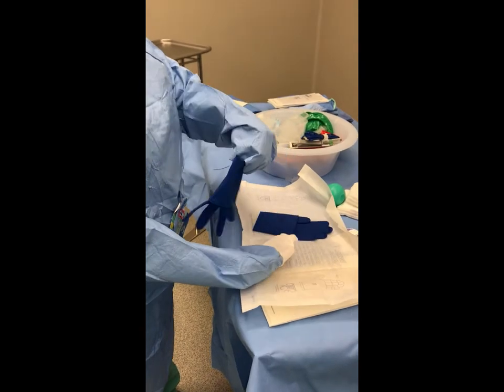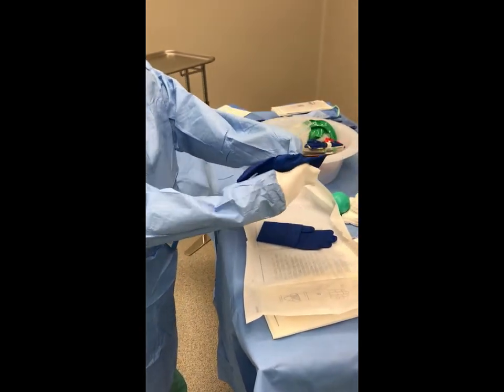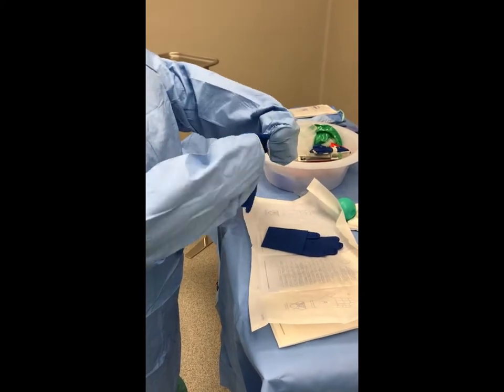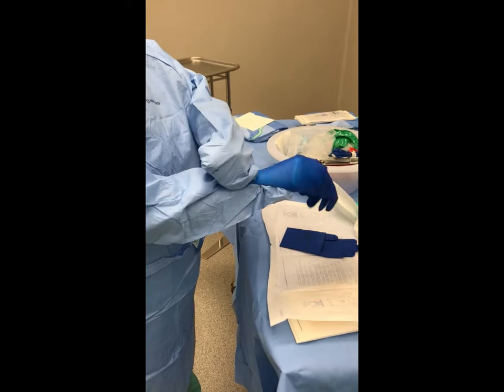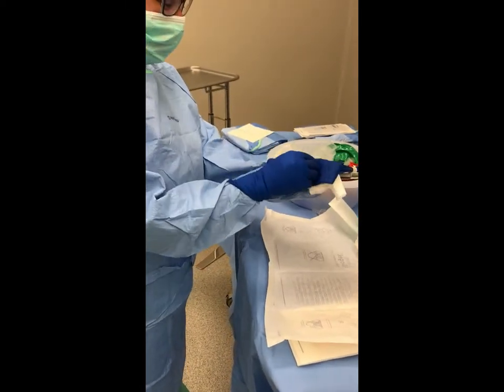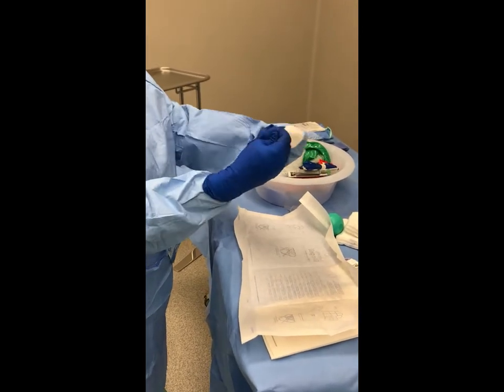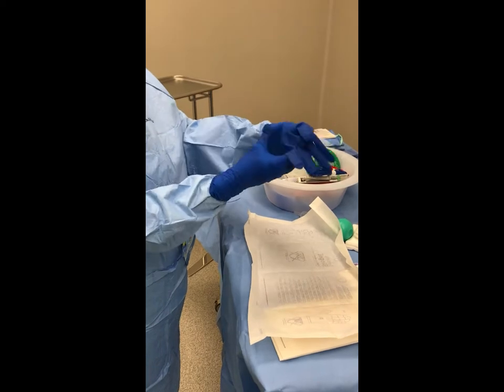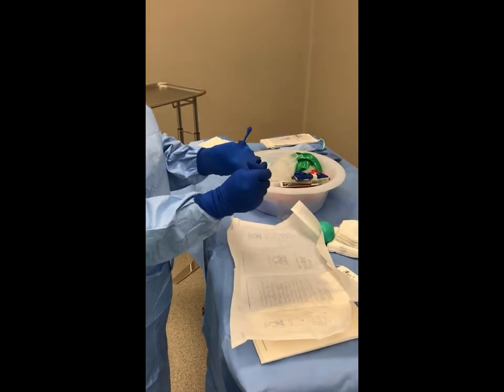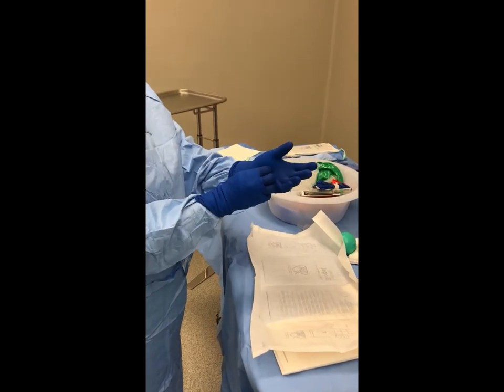Remember to place the glove palm side down with the fingers towards you as you pull the glove around your hand. Advance your hand through the sleeve and into the glove. Do the same for your second hand, then adjust your fingers if needed.